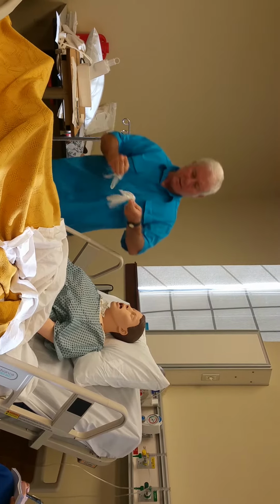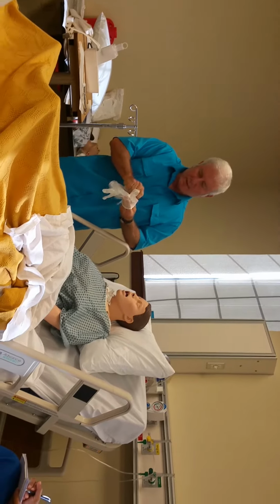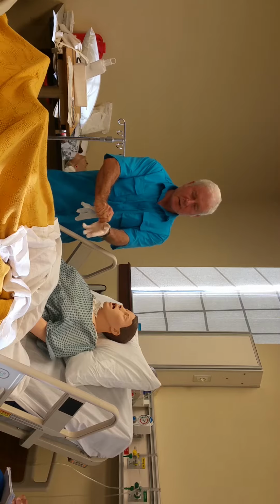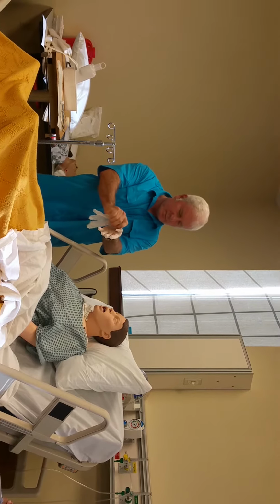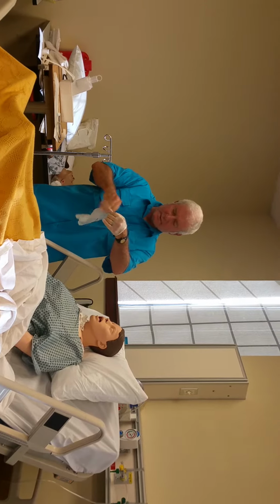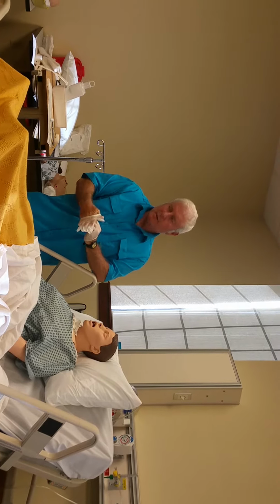This is a clean technique. We could possibly come into contact with body fluids, meaning gastric content. So we're going to put gloves on, before I even get started, so I don't forget.